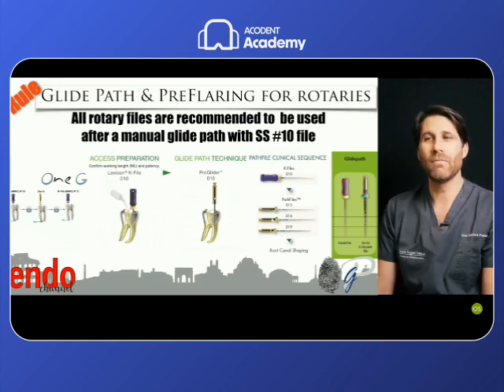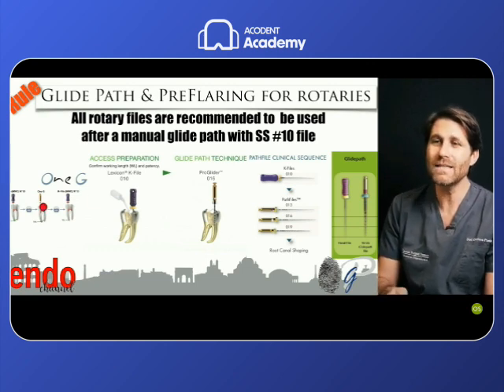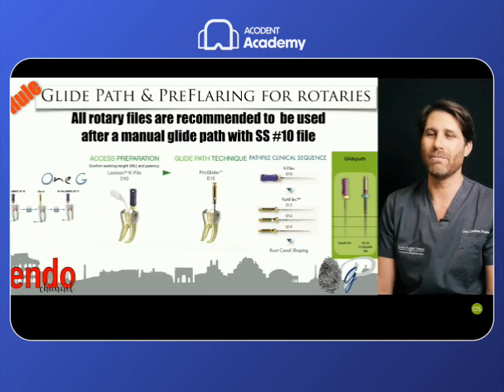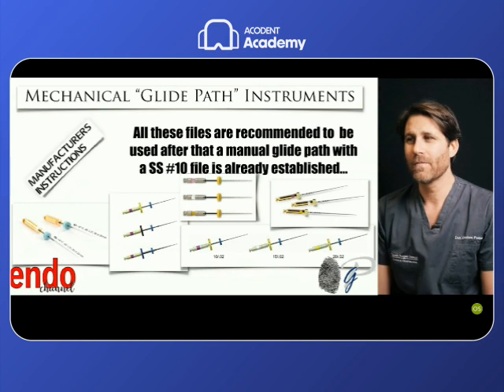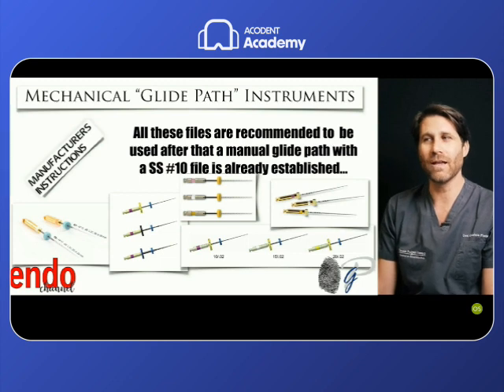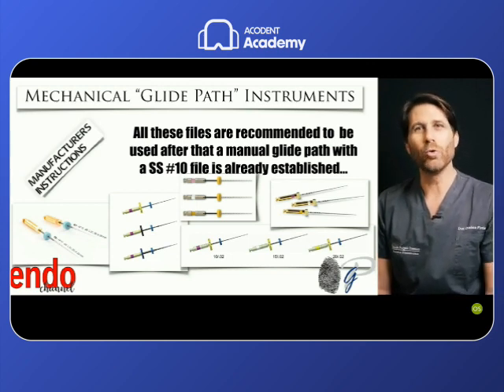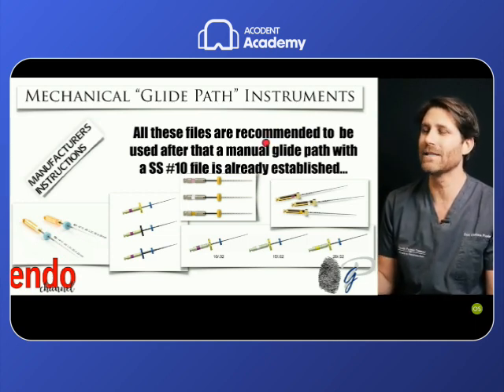So today on the market, they are marketed as glide path files. We have a lot on the market, but all these defined glide path files suggest the use of a 10K file before the use of the glide path file. They are marketed as mechanical glide path files. But honestly, I have to say, after this explanation of the endodontic terms that I gave you, that if we have already established, already used a stainless steel 10 file up to the end before using a mechanical glide path file, it means that we have already established a manual glide path as per the definition.